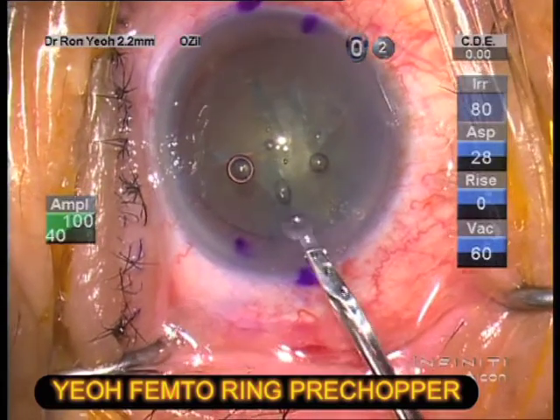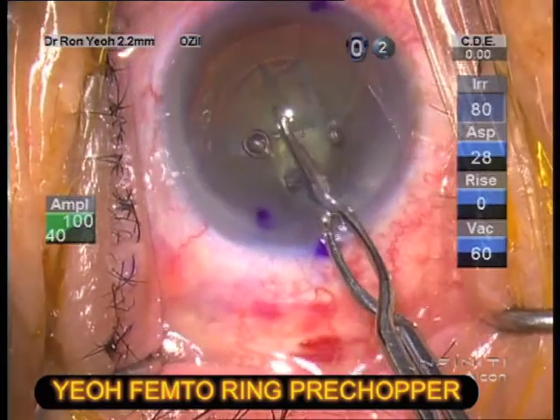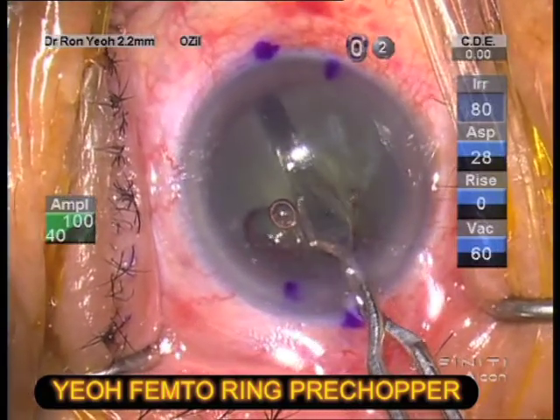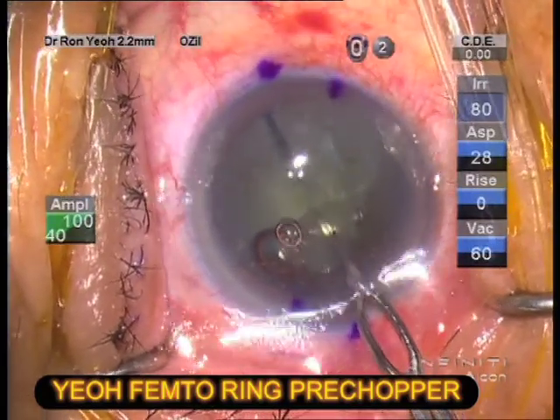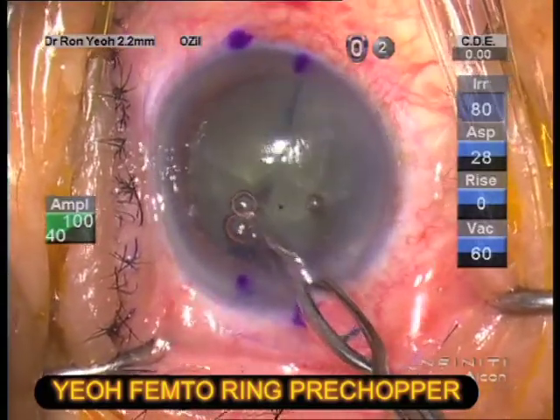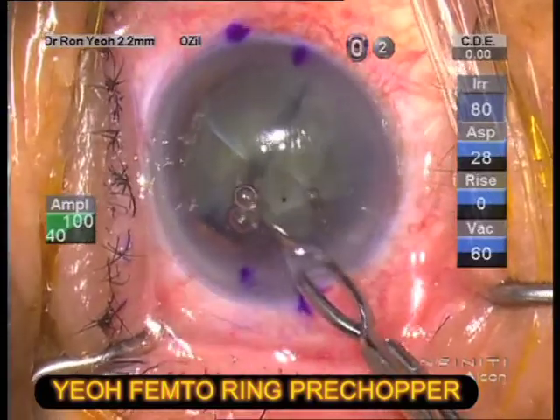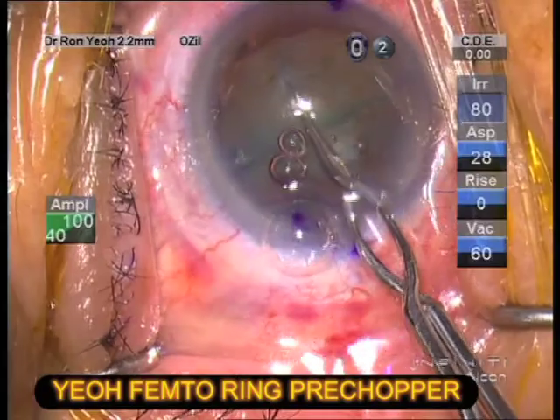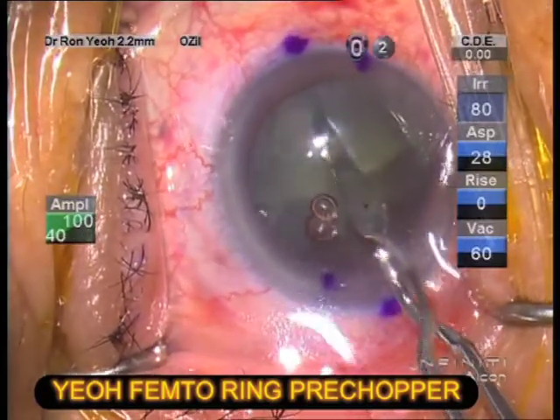This clip shows the nucleus being easily split with the new pre-chopper, which is inserted into the groove and separated, cracking the nucleus. Note how the incision does not restrict the opening of the thinner pre-chopper, allowing complete cracking of distal and proximal parts of the nucleus.